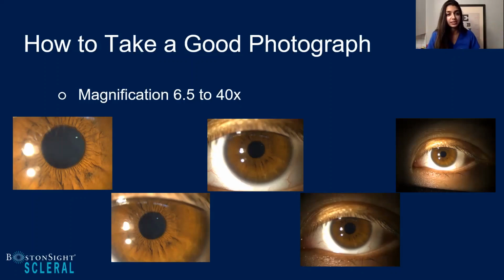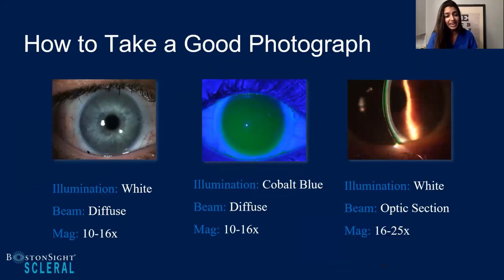As you can tell just on this slide, the various magnifications are going to give you such different pieces of information. Oftentimes I find if you're only working on one magnification, you're going to miss another part of the picture. So the goal is to continuously spin that dial for magnification. This is a great example to summarize how illumination and lighting, using different beam heights or types of beams, and magnification can give you different information.